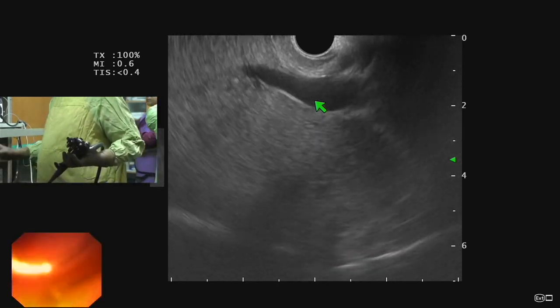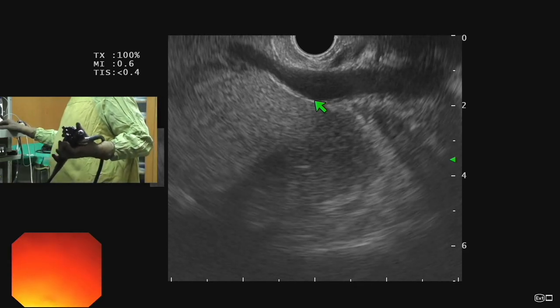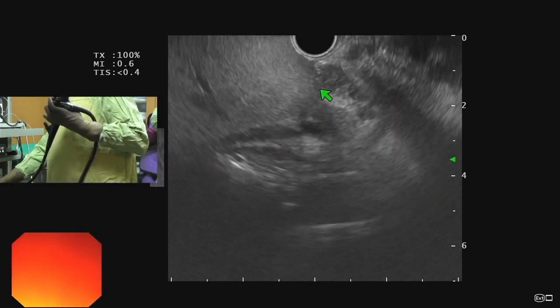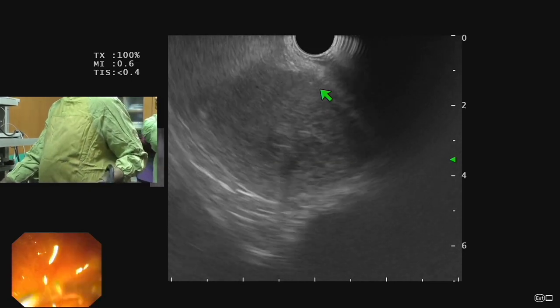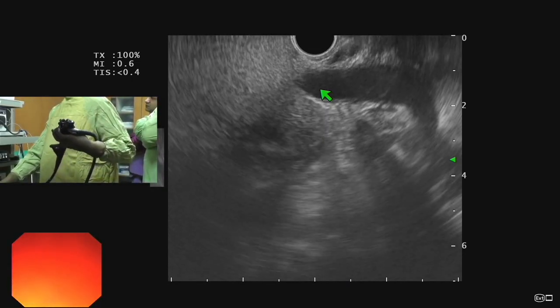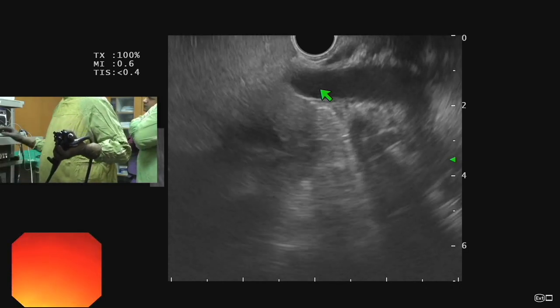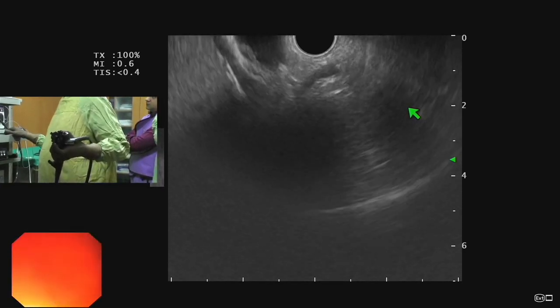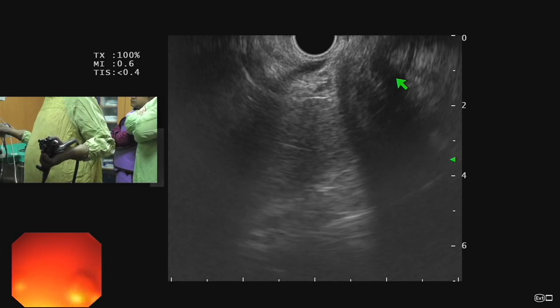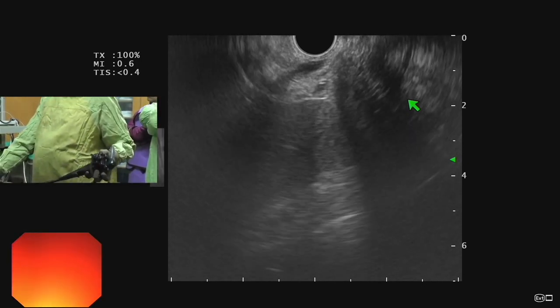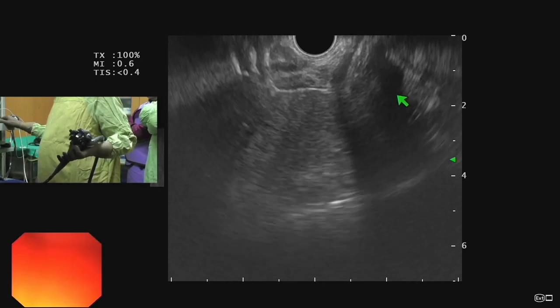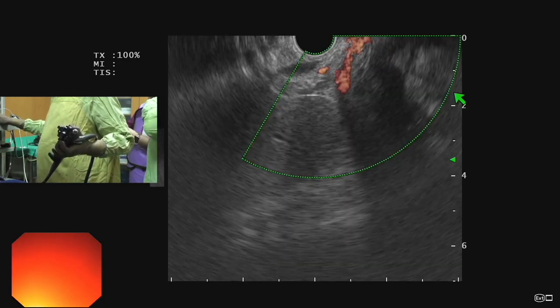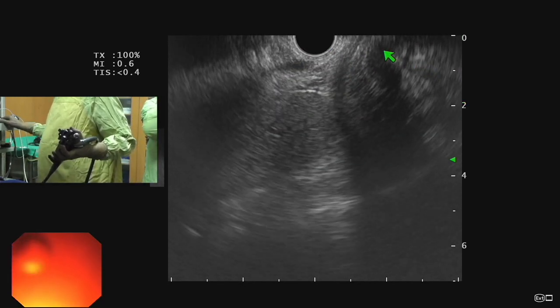From here we can see a dilated structure — that is the portal vein — with flow visible inside. Close to the probe is an anechoic structure which is the bile duct. If we rotate the scope clockwise from this position we go towards the lower part of the bile duct and can see the pancreatic head. Part of the pancreatic head is seen here, along with another anechoic structure — the pancreatic duct — with the green arrow showing it going vertically upward.